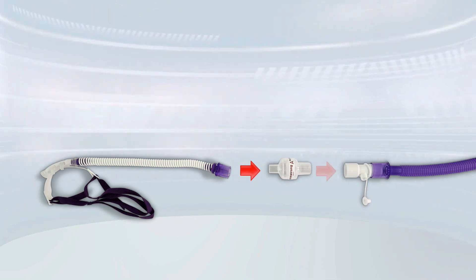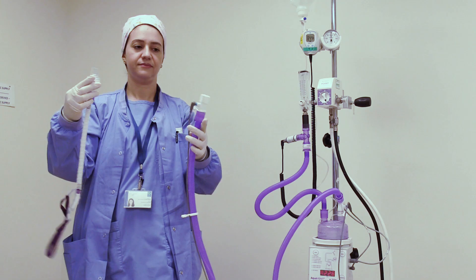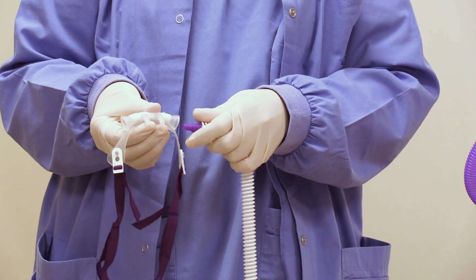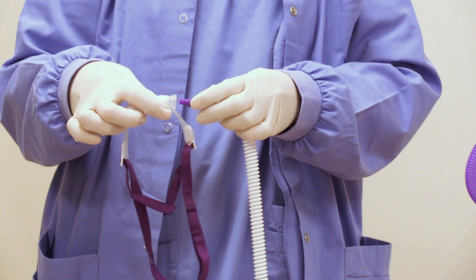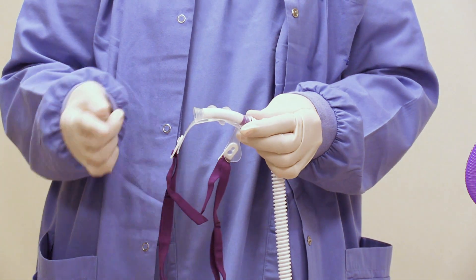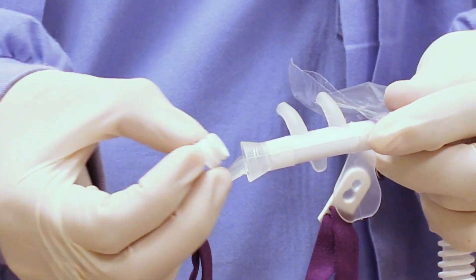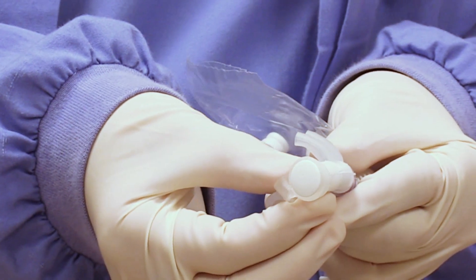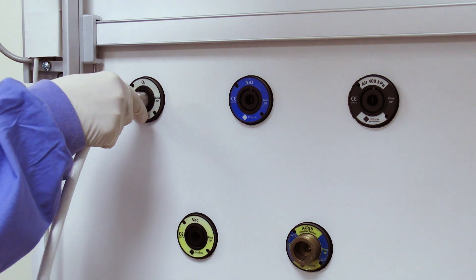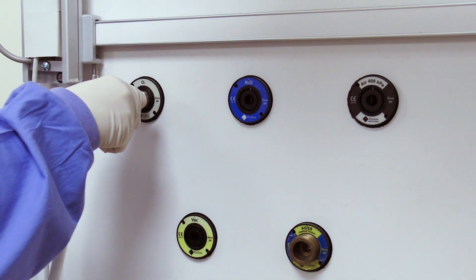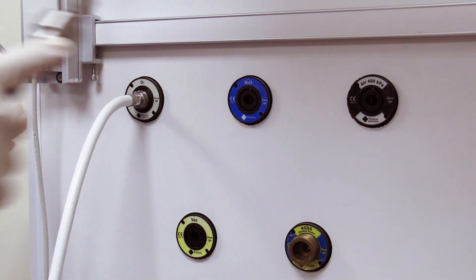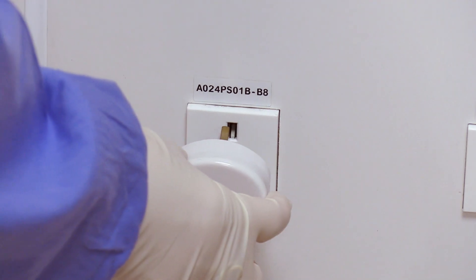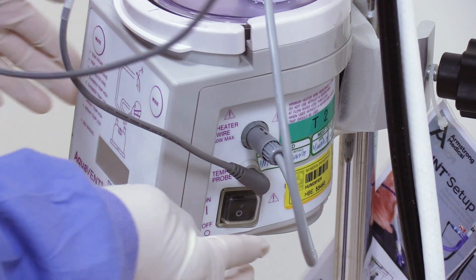Now connect the nasal cannula to the filter and then to the breathing tube. Some nasal cannulas allow fixing the tube on either side, so simply insert the tubing into the side that is comfortable and close the open end with the white cap provided. Connect the oxygen tubing to the pipeline supply — the machine will sound an alarm which will stop once you connect the tubing to the air pipeline supply. Then connect the power supply and switch on the machine.